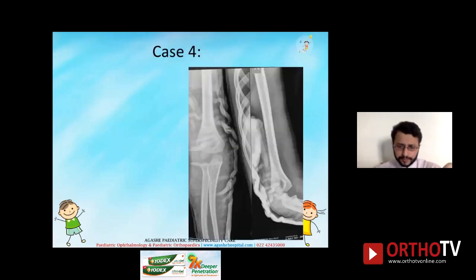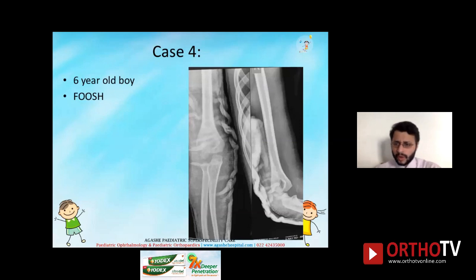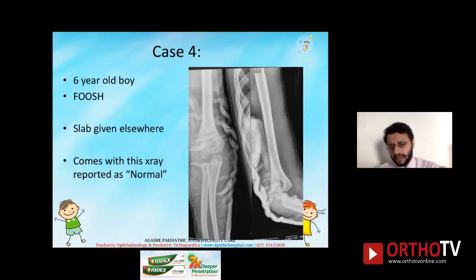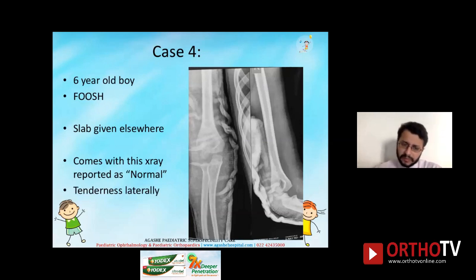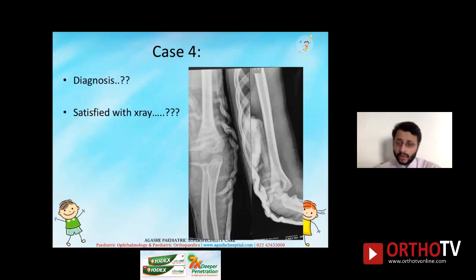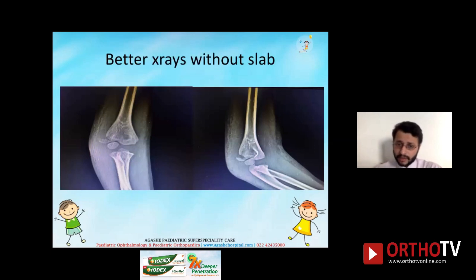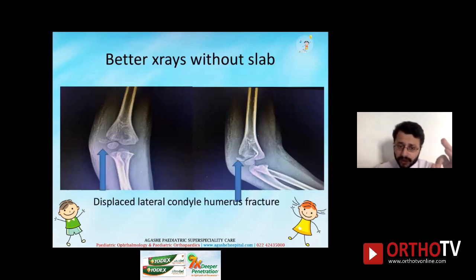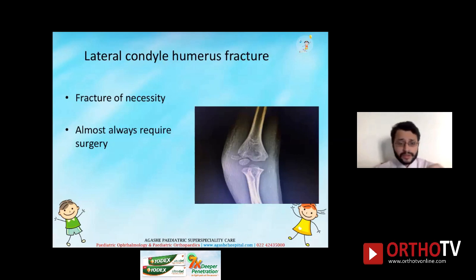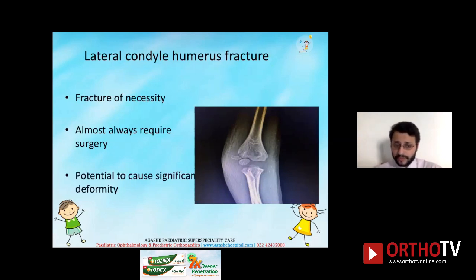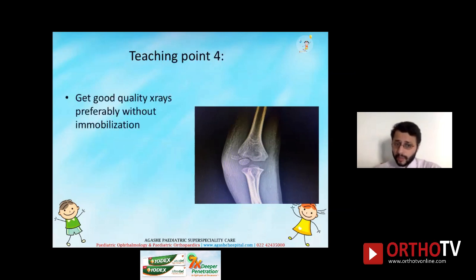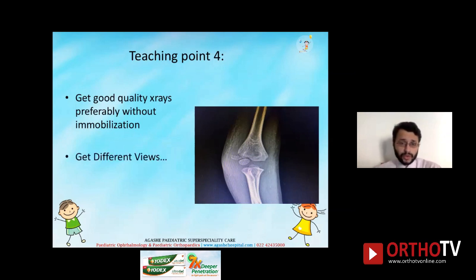D — Different views. A six-year-old boy fell on an outstretched hand, a slab was given elsewhere, and the X-ray reported normal with AP and lateral views. There was lateral tenderness. An AP internal oblique view without slab revealed a displaced lateral condyle fracture — a fracture of necessity that almost always requires surgery and has potential to cause significant deformity. Teaching point four: get good quality X-rays, preferably without immobilization, and always get more than two views — including internal and external rotation oblique views.